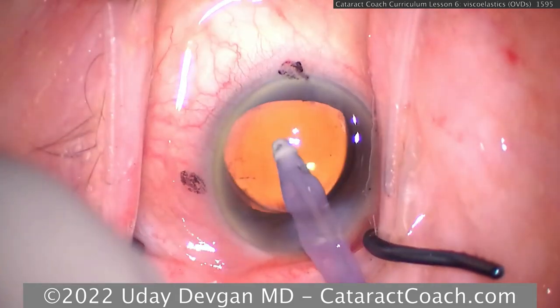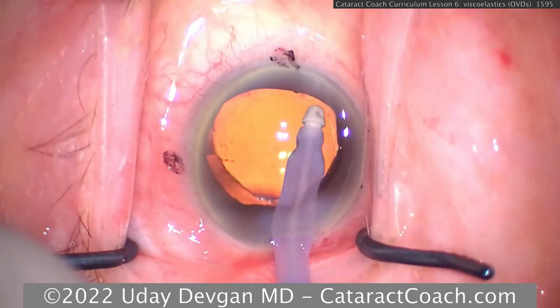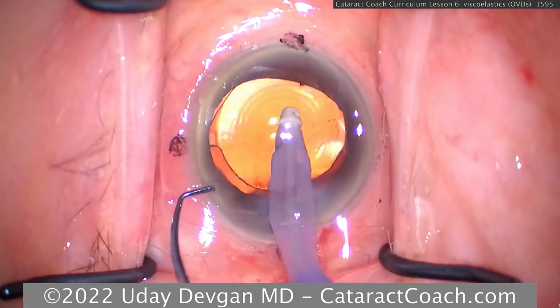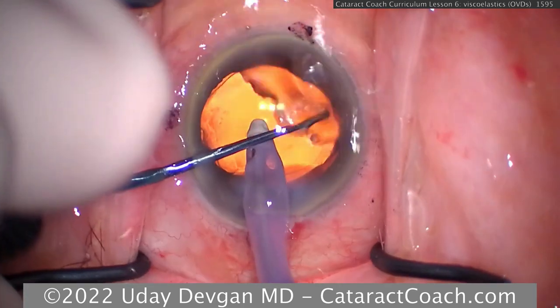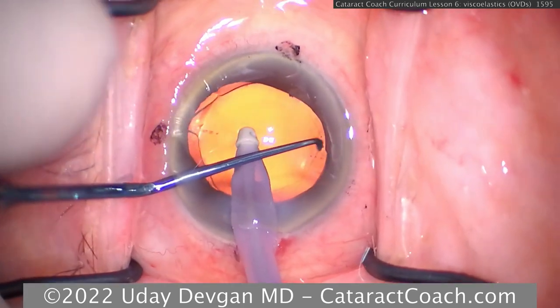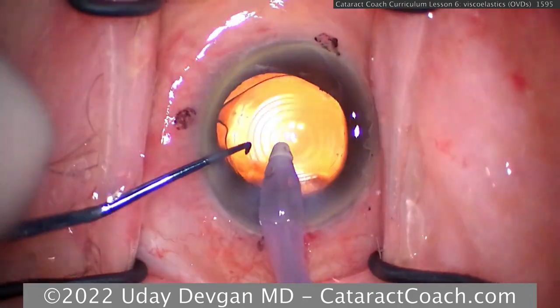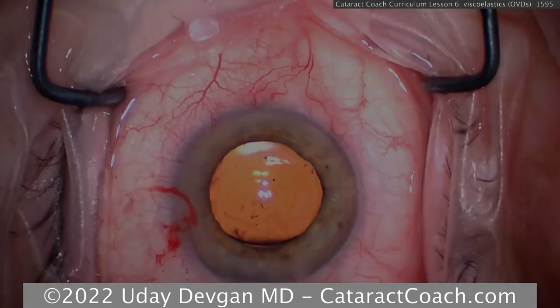It'll stick to the capsular bag. But it'll only stick to the capsular bag if there's no viscoelastic there. Viscoelastic behind the optic would allow it to slide and move around, and we can have this toric lens shift to the wrong axis, or we can have the IOL optic rings shift out of the center of the visual axis. So in that case, certainly it's very important.